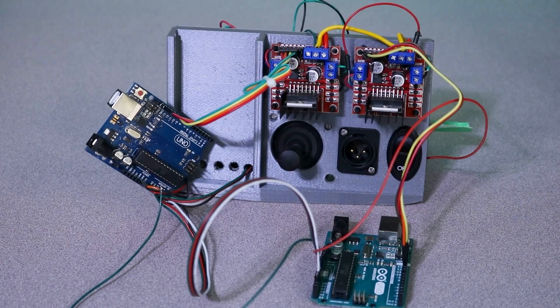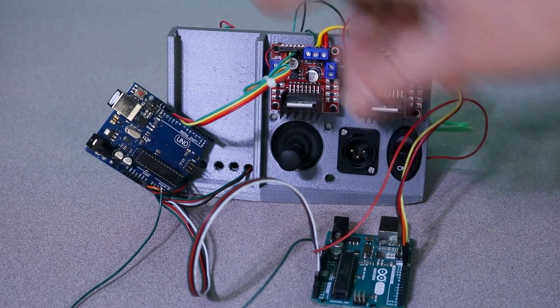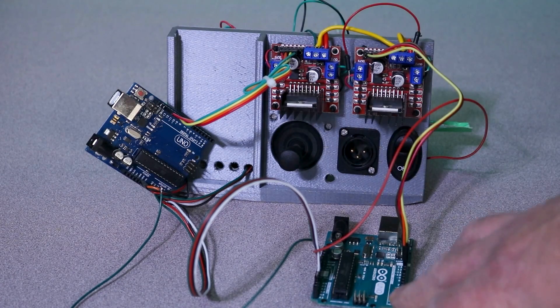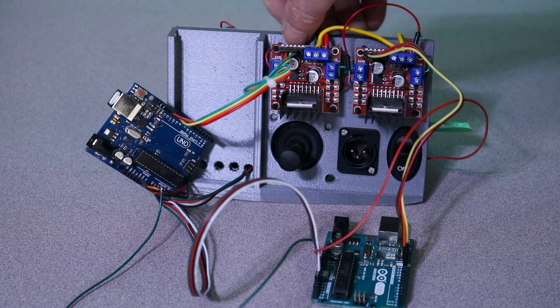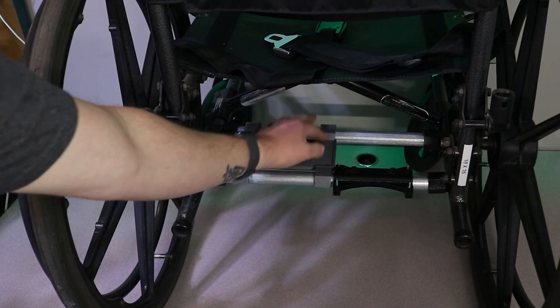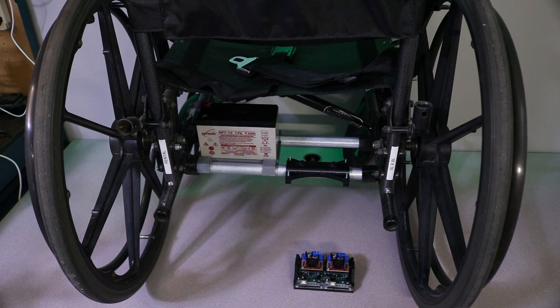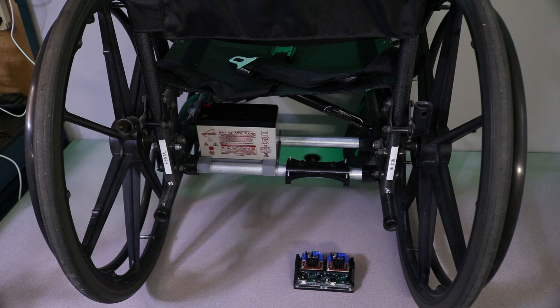This is the original demo station that I had built. When I first started this project, I was just going to use one Arduino Uno, but there were some issues with too many commands causing glitches in the code. So I decided to go with the dual Arduino board setup. We're using three-quarter inch EMT conduit, and there's the battery: a Genesis NP712 — 12-volt, 7-amp hour battery.